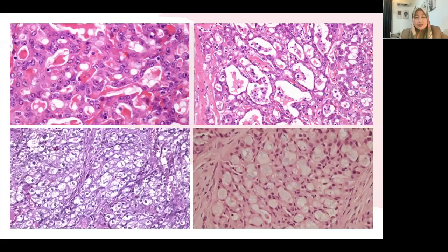We really found that secretory carcinoma has numerous secretory components, like what you see in this picture. We normally think of secretory carcinoma when we have abundant secretory components, and sometimes it looks like adenoid cystic carcinoma, like in this picture.